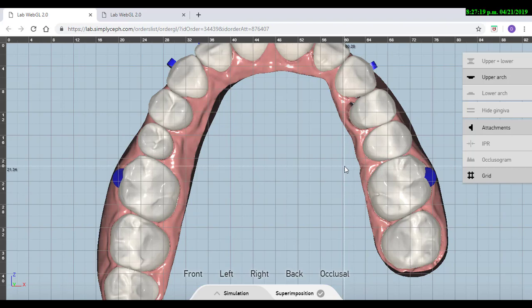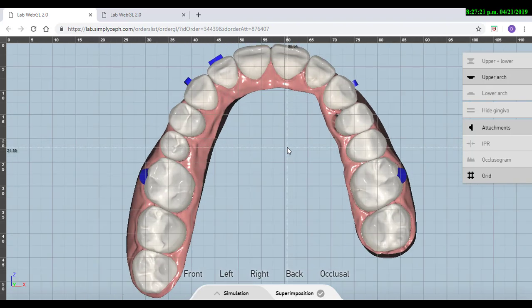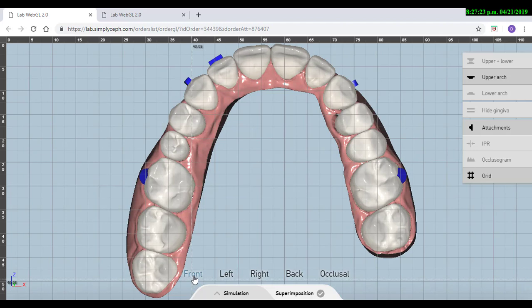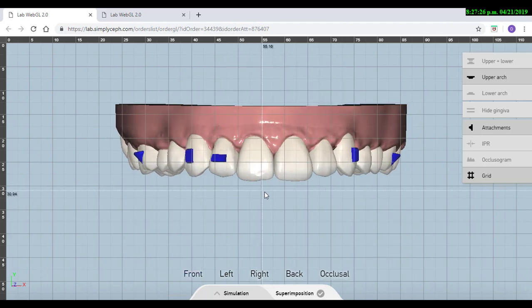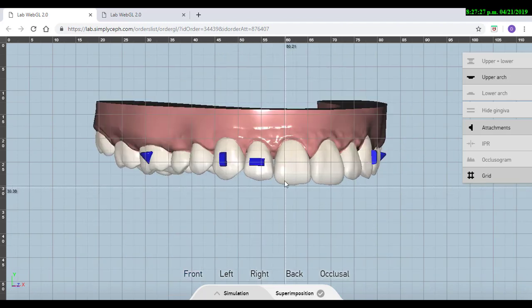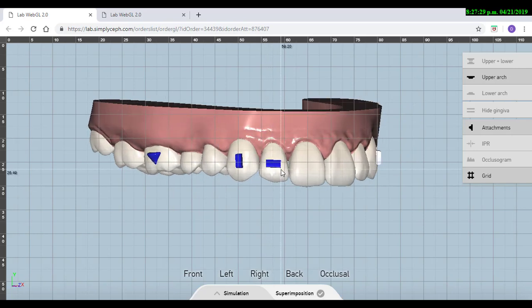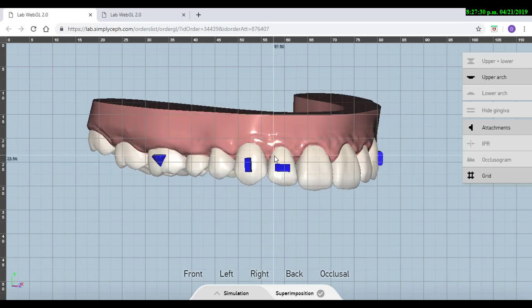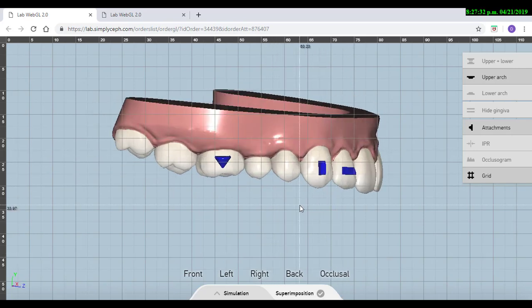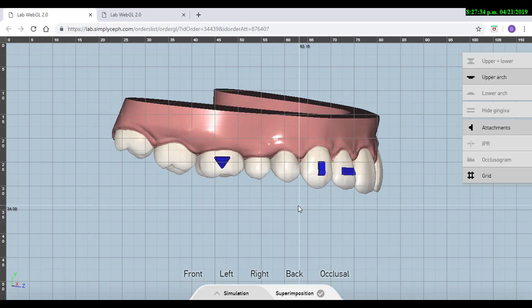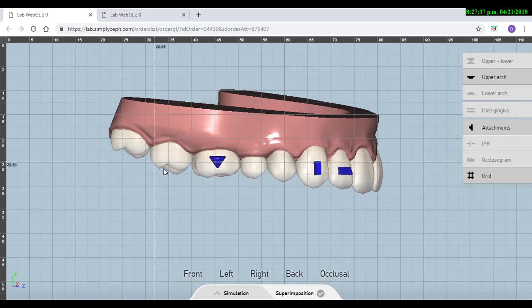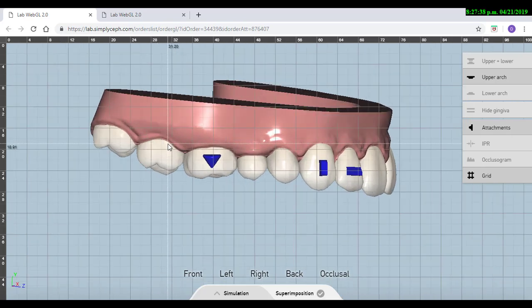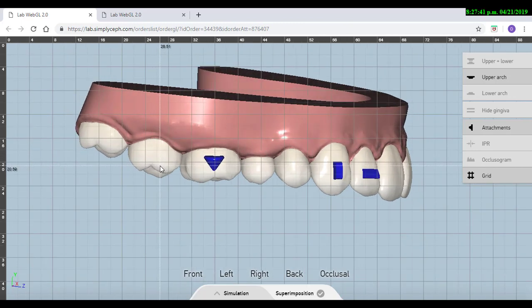I want to see the angulations, so crowns should always be going towards mesial and roots towards distal, so that is something else that I'm going to verify in here. For example, this second molar on the upper right side, I will do a little bit more angulation. I will do crown towards mesial and root towards distal.